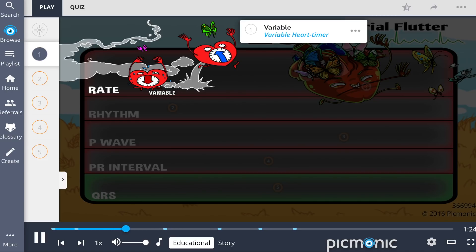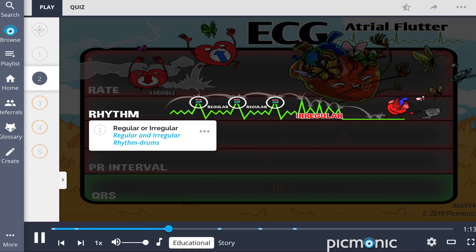The atrial rate typically ranges between 200 to 350 bpm, while the ventricular rate, based on the conduction rate, is approximately 100 bpm. Although atrial rhythm is regular, ventricular rate may be irregular in individuals with atrial flutter. This regular or irregular rhythm is illustrated by the regular and irregular rhythm in the ECG strip.